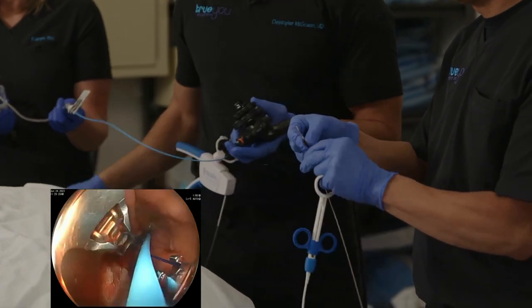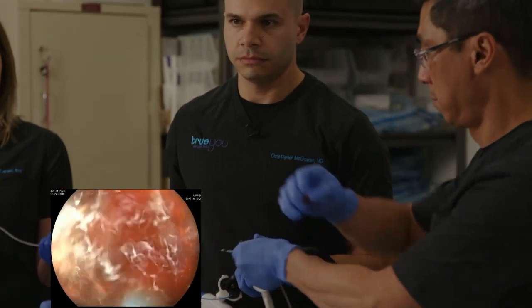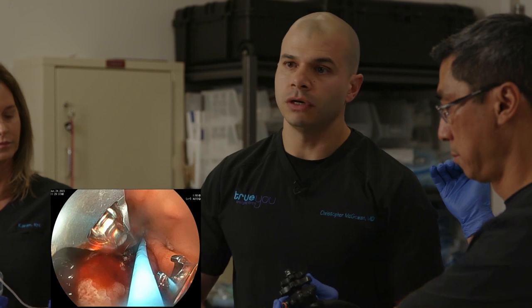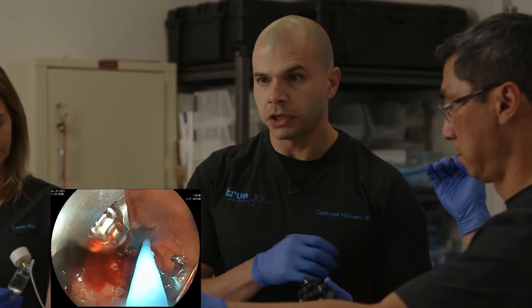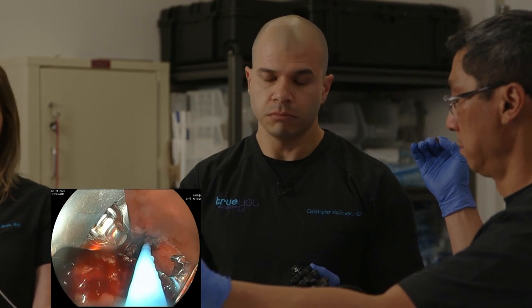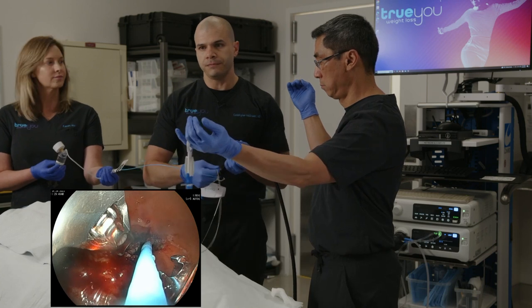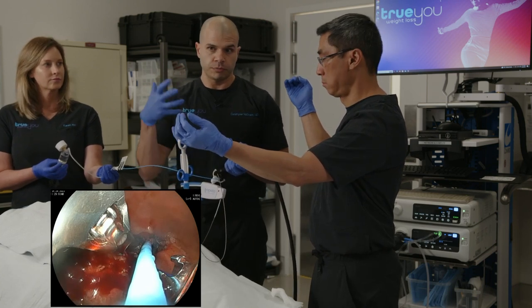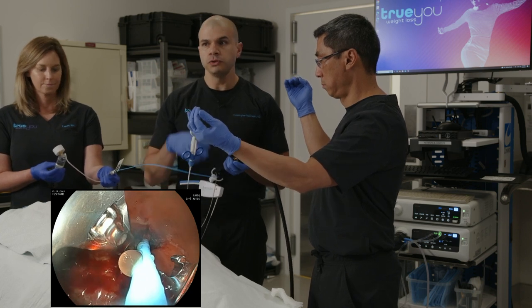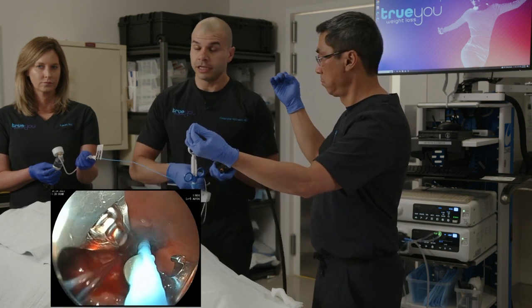And I will take another question now. Camila from Facebook wants to know, is there a need to assess the diameter of the opening prior to the procedure? Not really. In general, just based on a patient's story, on their history, we will know if things have stretched. It's also generally inevitable that the outlet will stretch over time. So if a patient reports the ability to eat larger portions, we can be pretty confident that things have dilated. So we do not pre-screen every patient, just knowing from experience that it's not necessary.